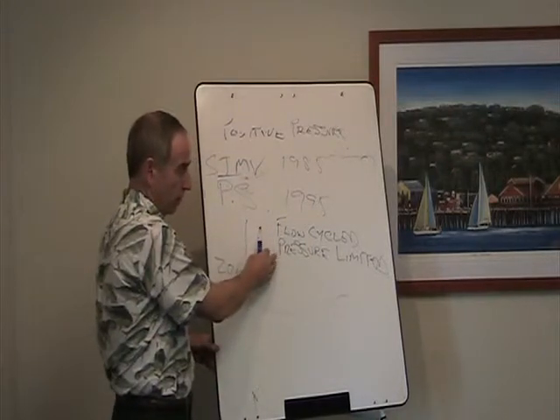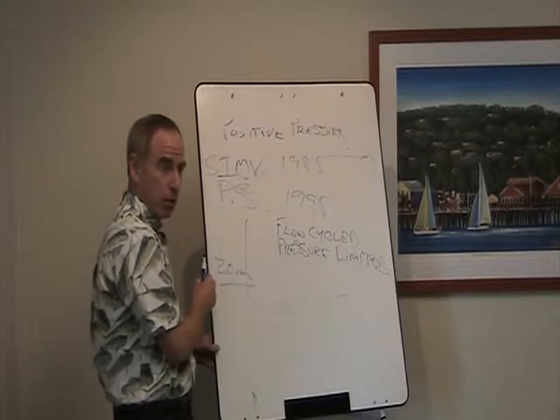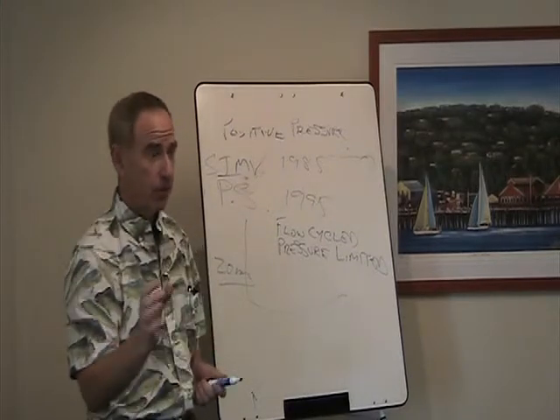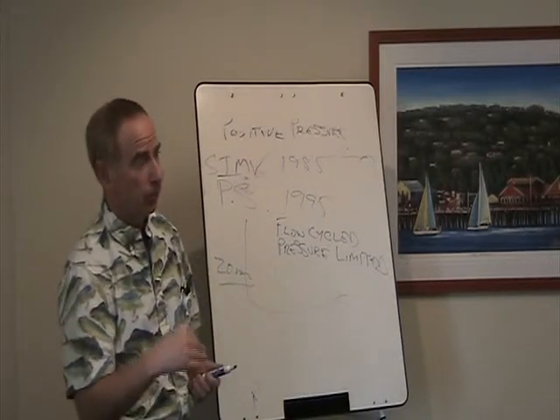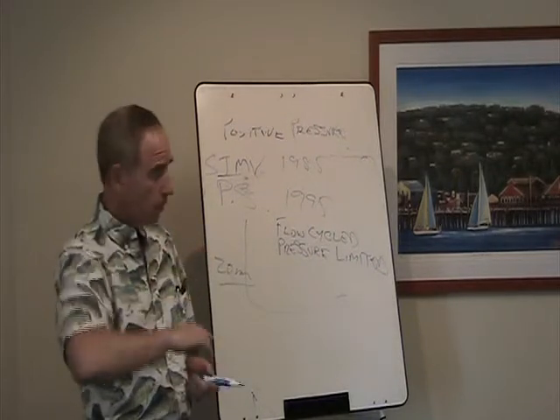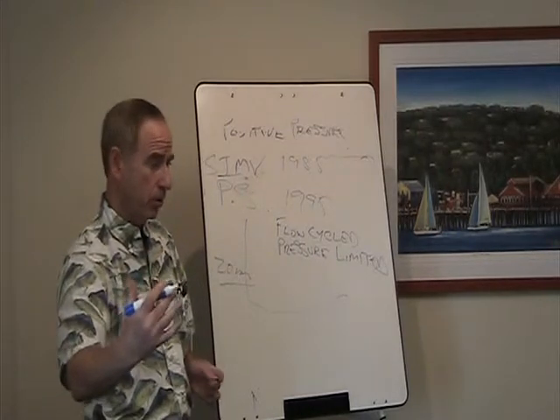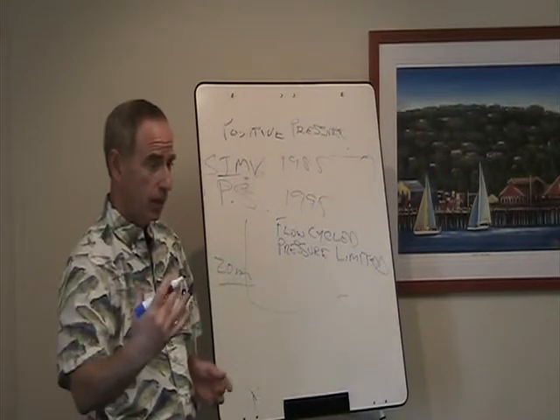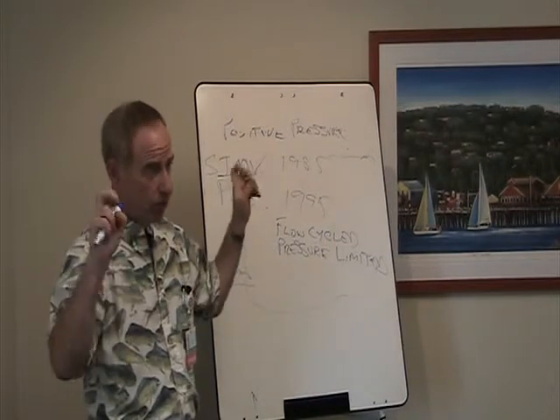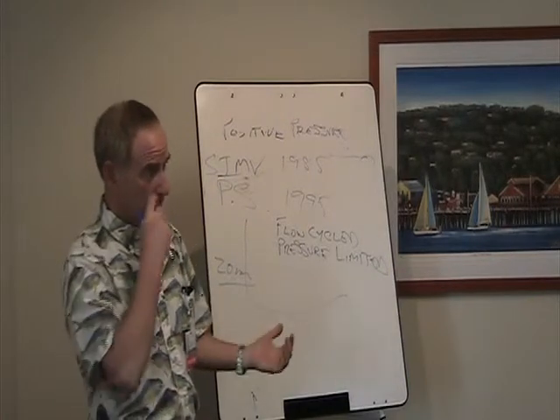So in this mode of ventilation, pressure support, it's pressure limited because we dial in a pressure, but it's flow cycled. Well, what does that mean, flow cycled? That means the ventilator senses the flow rate that it's delivering. When the flow rate drops down to about 25% or so of the initial flow rate, it releases. That's how the ventilator knows, in quotes, to stop giving that pressure.